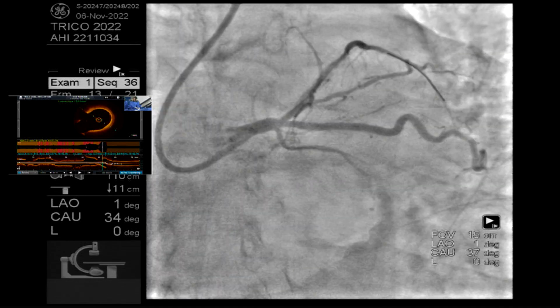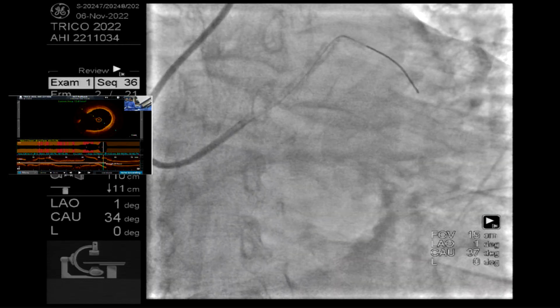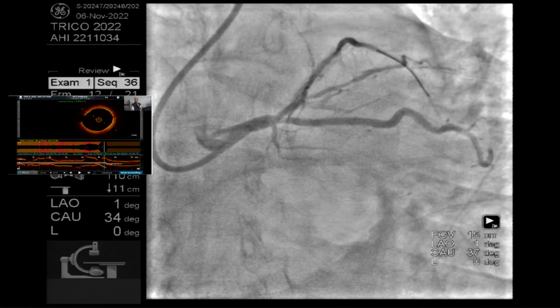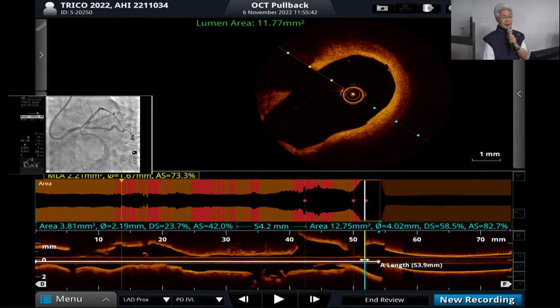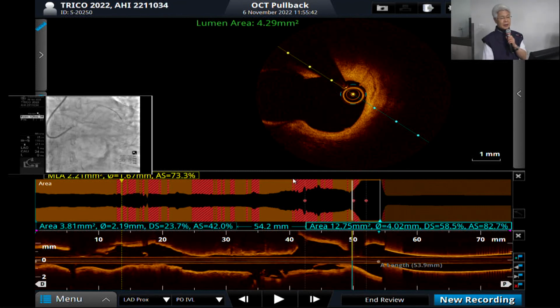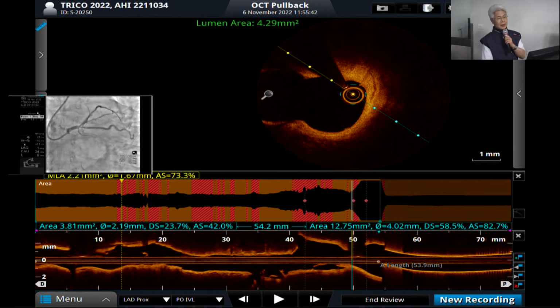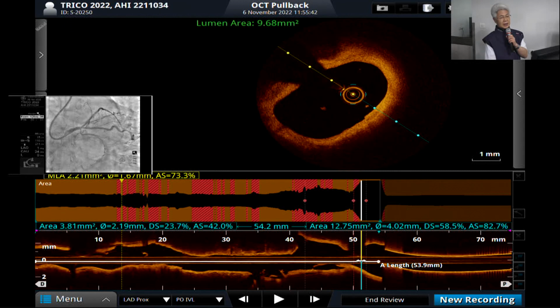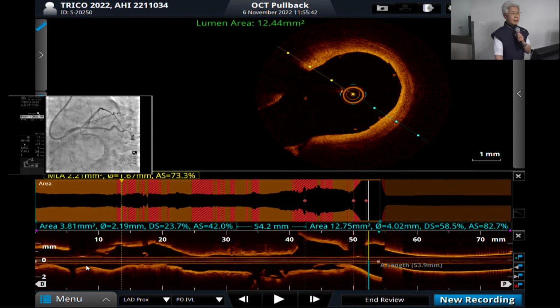From the OCT, can we see the ostium of the ramus? Yeah, that is seen there. Can you see the left main, right? Yeah. Slowly, yeah, here is the CX, right? At 8 o'clock. And you can identify the orifice of the ramus is a little bit different here, right? Actually, the bigger one is ramus and the smaller one is LCX. Yes. This is ramus. And a little bit proximal side, we can identify the LCX, right? Yeah. Bigger one. So this looks good. Good. Nicely seen also. Very nice demonstration.